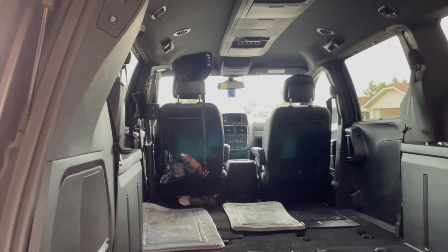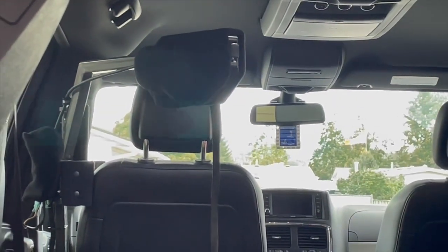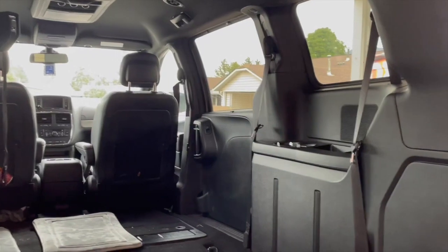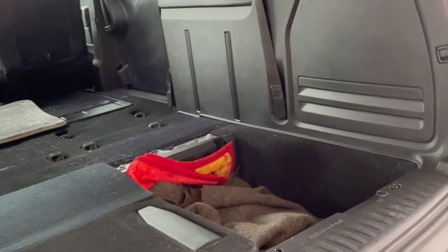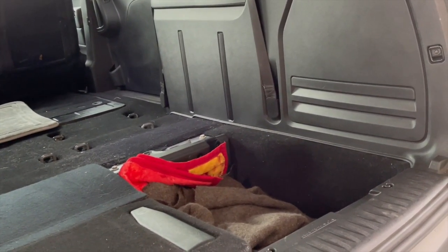You might also be able to see the lift that carries my wheelchair into the van — I'll have a whole video on that later. This is a shell. The other adaptation I've made is I've taken out the 40% part of the 60-40 bench seat that folds into the floor.